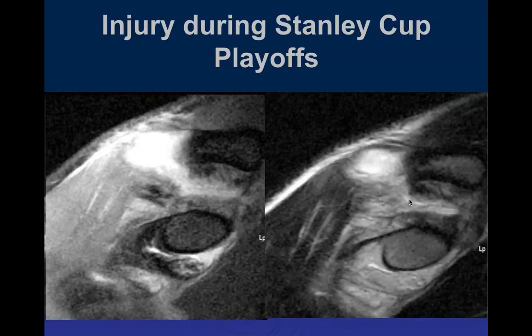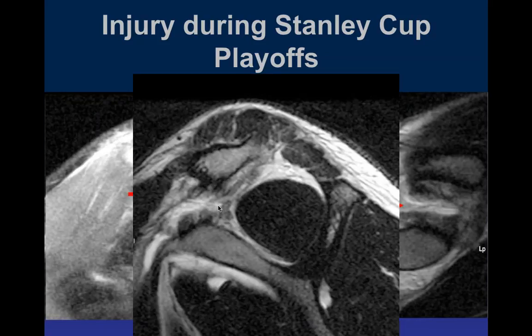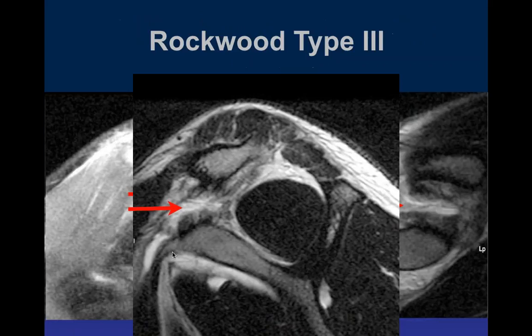On the coronal fat-sat and T2 sagittal images, there's signal within the mid-substance of the CC ligament going across, indicating a CC ligament tear. There's not much elevation or displacement of the CC interval. Another image confirms it is torn, making this a Type 3.